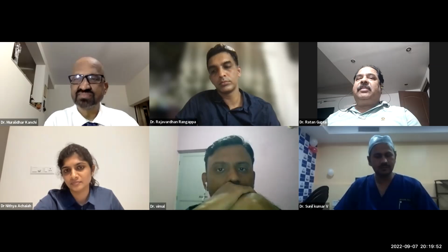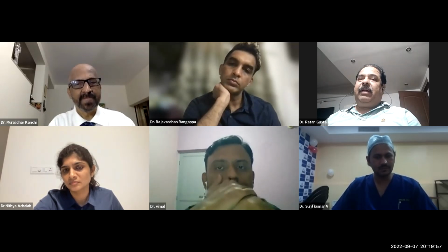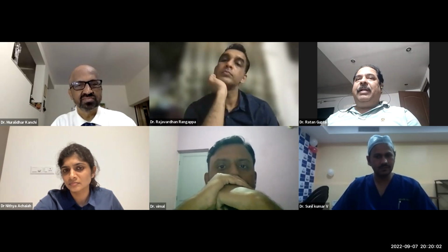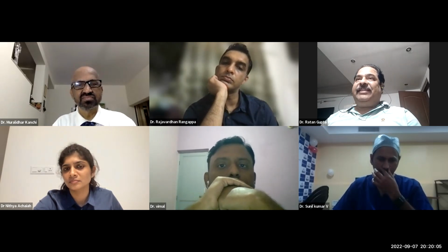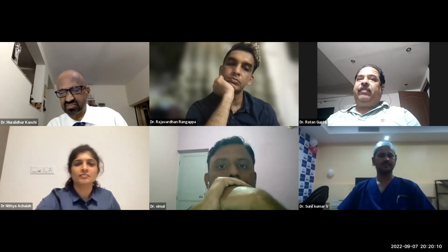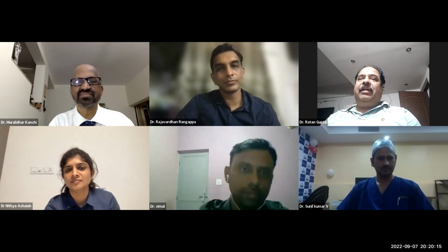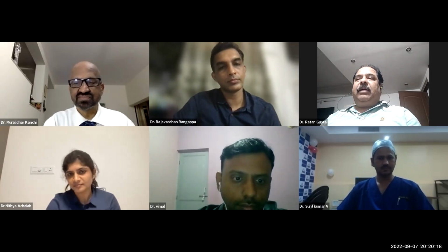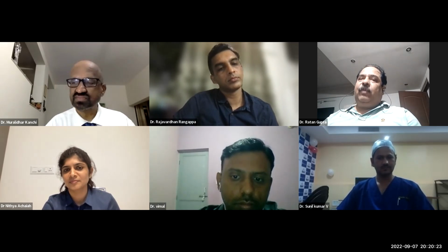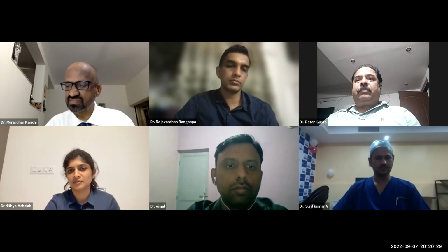But in case you use a combination technique, we use a Griggs forceps for opening up the tracheal opening and gauging how much has to be opened, and subsequently just use the rhino horn for sizing. That combination helps, and it works quite well sometimes. Of course, it depends on the individual institute and their policies, but sometimes this combination can be considered so that it becomes more successful. And of course, you can reuse the kits as well.